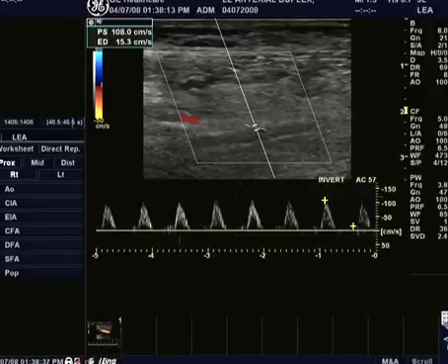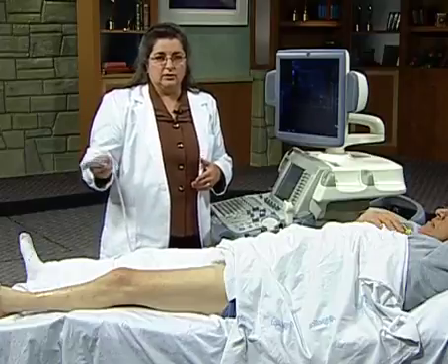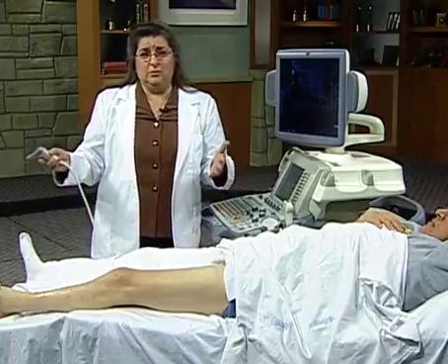And here in the outflow vessel, which is the distal posterior tibial artery, we have a velocity of 108 centimeters per second. So it is really perfect. There's no focal elevation. We scan through there both in color and spectral Doppler. And really that is a complete exam.